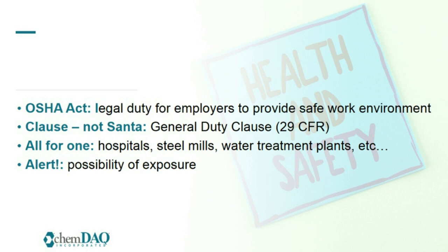The air contaminant standard and the ETO standard are performance standards that set goals that leave the means to achieve the goal up to the employer. It gives the employer the flexibility to select the means best suited to their application, meaning that they can select it, but they have to select it. They can't not select it. And to me, that's kind of alerting.